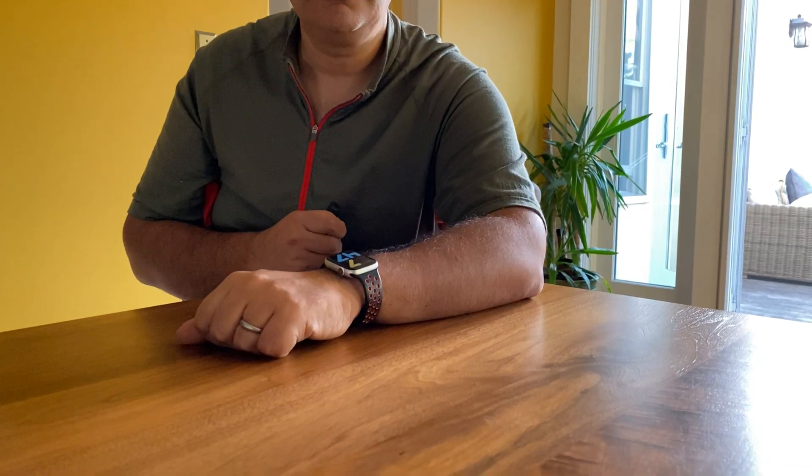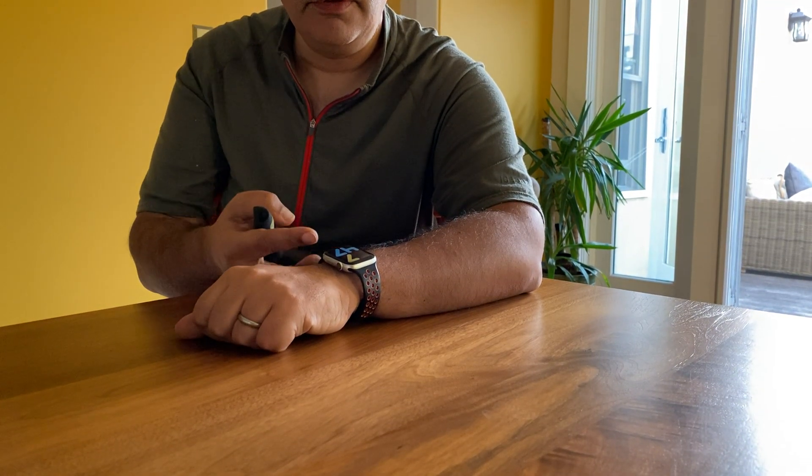One of the most basic features of VoiceOver is that when it is on the watch face — which is the display that comes on when the watch wakes up — is the time. If we touch the screen when we're in the watch face, it will read the time to us. 7:47 p.m. Also, if the watch face is asleep and I touch the screen, it wakes up the watch, and because VoiceOver is on, it reads the time.